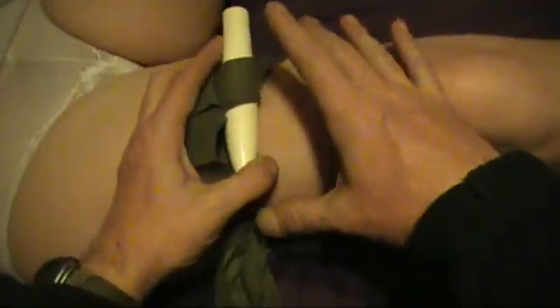Now, like I said, look around. Now, the environment that I'm in right now, of course, is the bedroom. So what do I have that I can stick in as a windlass? Grab the first thing that you can think of, okay? Stick it in there, crank it down, okay? Now, the thing you have to pay attention to is this is going to pinch the skin, okay? Once again, pain versus death. We used to stick stuff up underneath here so that it would tighten down and it wouldn't pinch the skin. Whatever. Just crank it down till the bleeding stops.